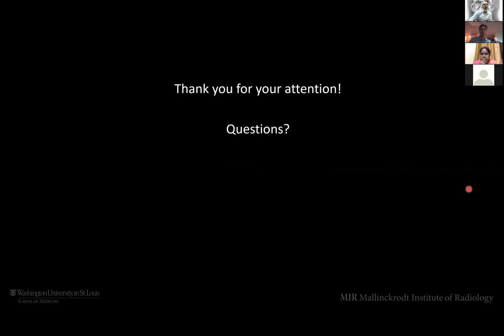And of course, you have Dr. Kavita. She can tell you more about PET CT than I could. But at least in general, that's the experience with liver focal lesion characterization.